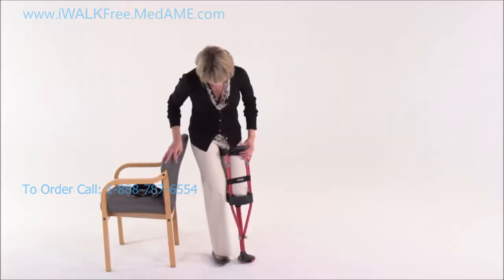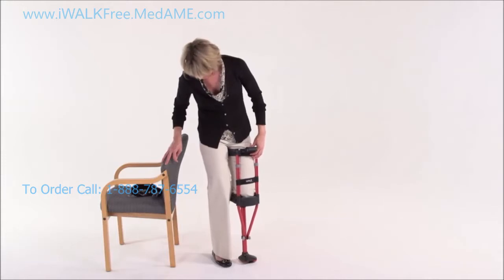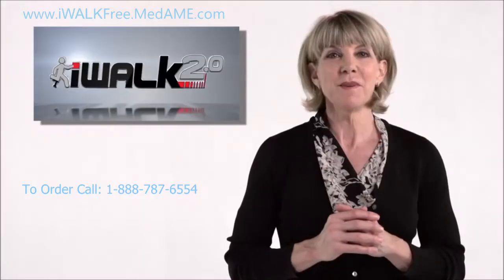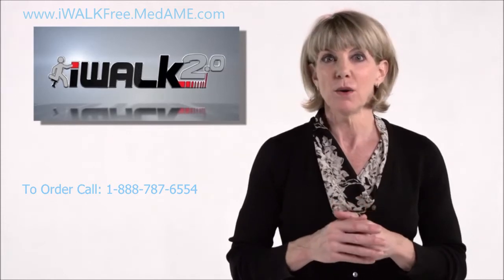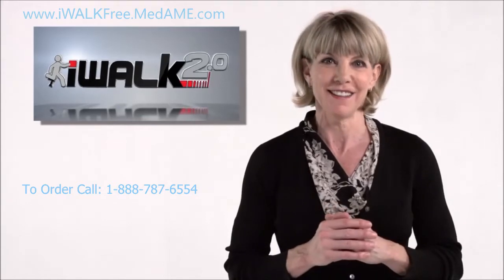In a moment you're going to kneel on the platform, but before you do, remember that at this point you're holding the crutch up and it's not supporting you. So make sure you have a helper or a handrail or some other stabilizing surface you can rely on in case you lose your balance.